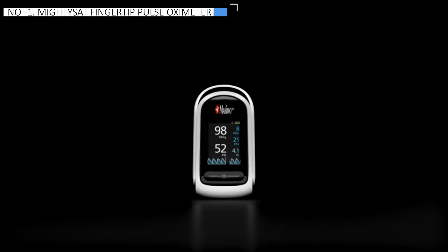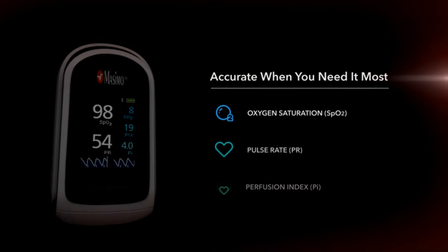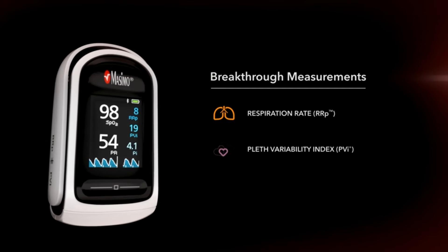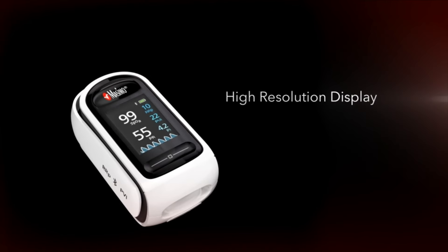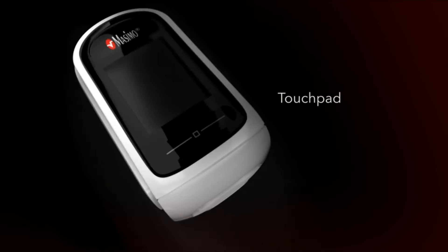Finally, the Masimo MightySat fingertip pulse oximeter emerges as the market's top choice, securing the number one spot. The Masimo MightySat is a reliable health monitor that provides a lot of valuable information quickly and consistently. It tracks various data, including blood oxygen saturation, pulse rate, respirations per minute, perfusion index, and pleth variability index.